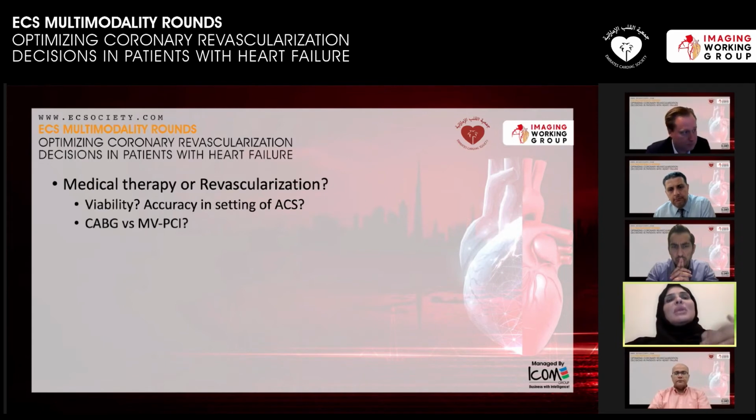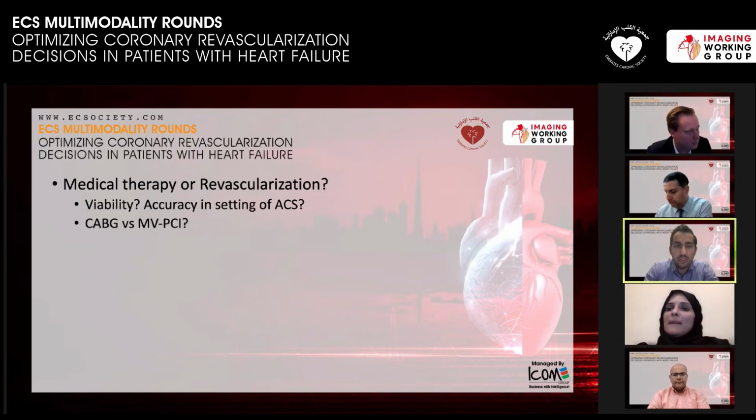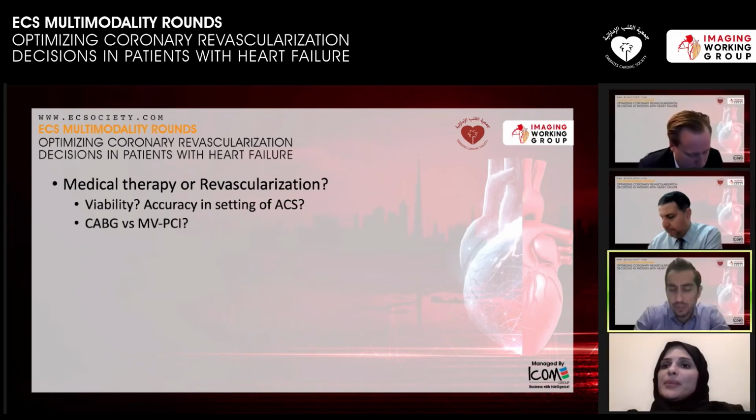In the setting of developing a thrombus and thin wall, what's the time window of these echo images within the acute setting? Because it looks like subacute images, if I'm correct. Well, it's hard to say, but the patient's symptoms were within 2 to 3 days of transfer, and the echo would have been upon arrival. So probably a few days after the event itself.